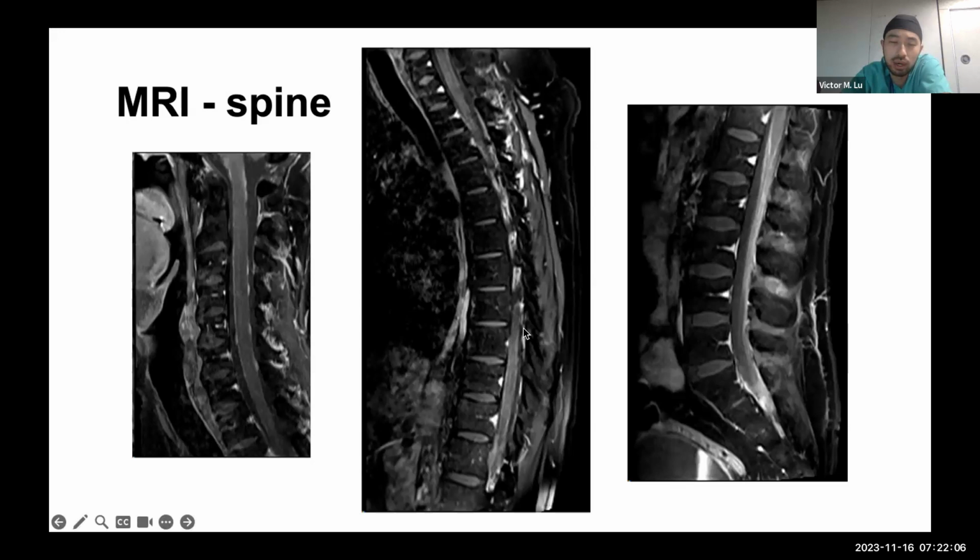And if you actually go ahead and, that's on the thoracic list, but you can still see the enhancement from the bottom of the cord as it goes down all the way to the conus. Actually, you can see all that enhancement. So if you had to give it a word, you would say you think there's a leptomeningeal progression of this disease. Yes. So that is it.